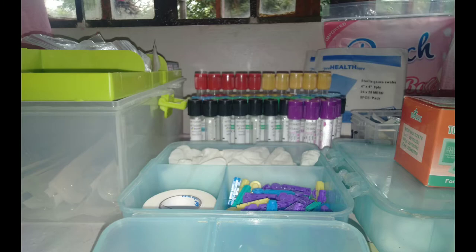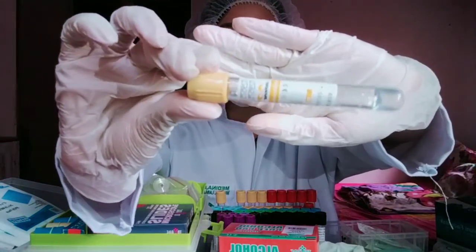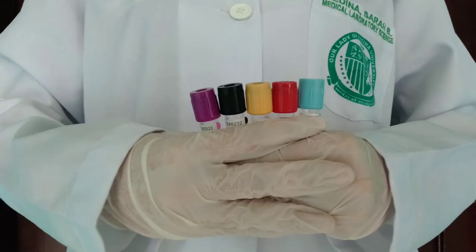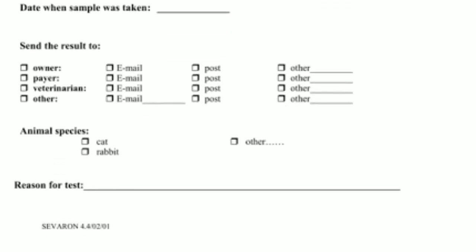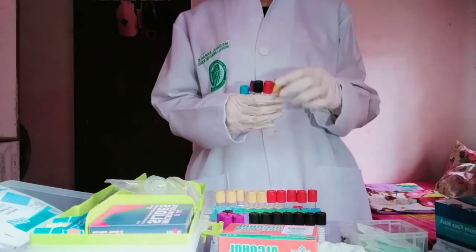In the phlebotomist tray, equipment is organized for drawing blood. Blood collection tubes are designed to fill with a predetermined volume of blood by vacuum. The rubber stoppers are color-coded according to the additive the tubes contain. The phlebotomist determines what tests are ordered and what tubes will be necessary before beginning to draw blood, and also determines the order to draw the tubes.